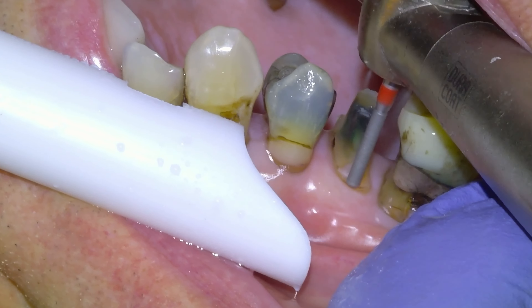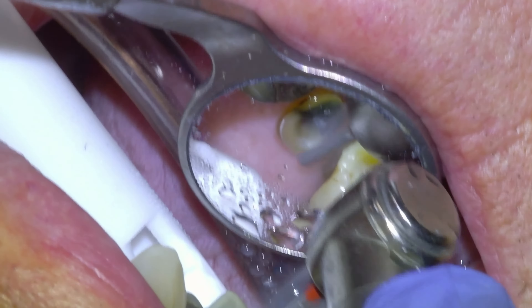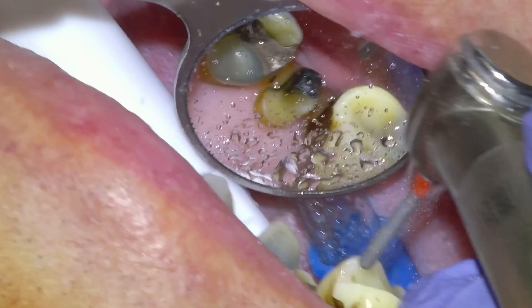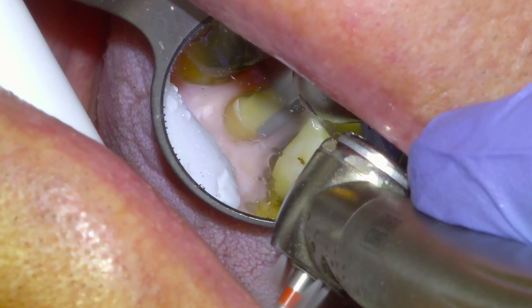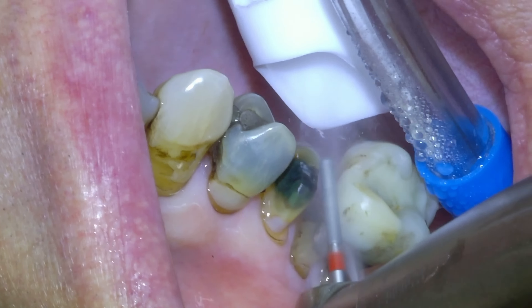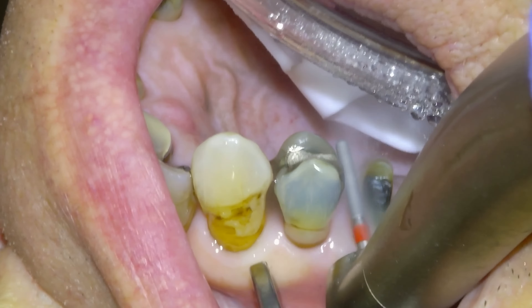The patient is actually quite a success story — you can see the 16, a retired physician using the 16, has big furcation involvement and it's been like that for years. The gums have been healthy and stable for quite some time, nothing mobile. We'll finish the prep with our fine diamond, just smoothing off any sharp corners, and then smooth off the contours of the interproximal teeth to make it a little more cleansable and hygienic.